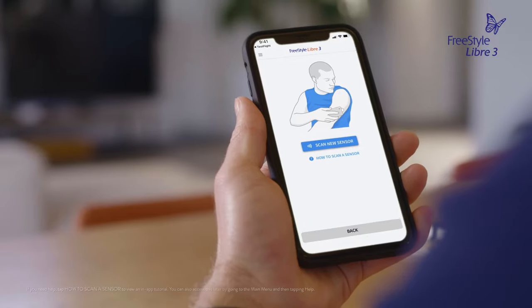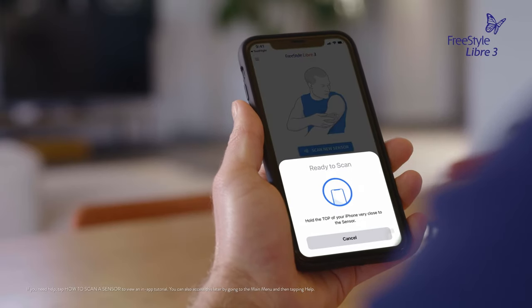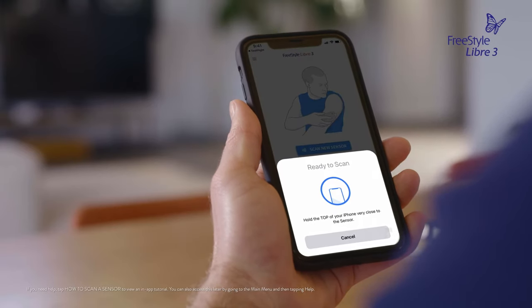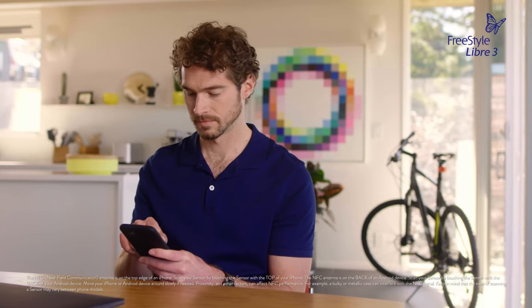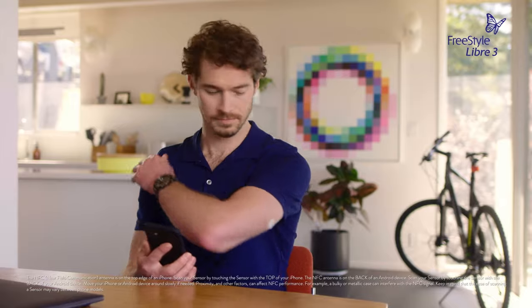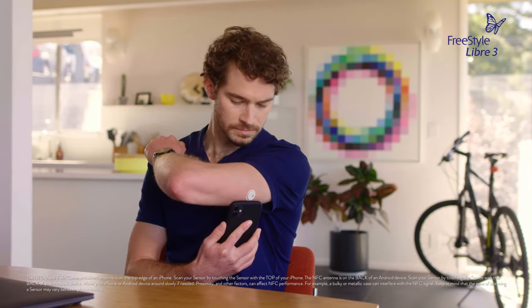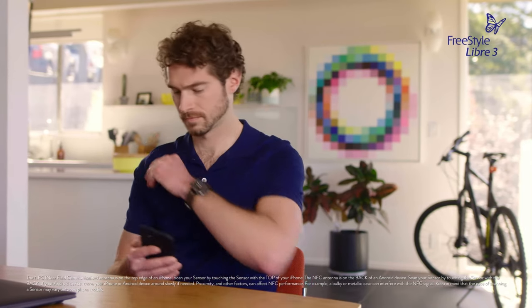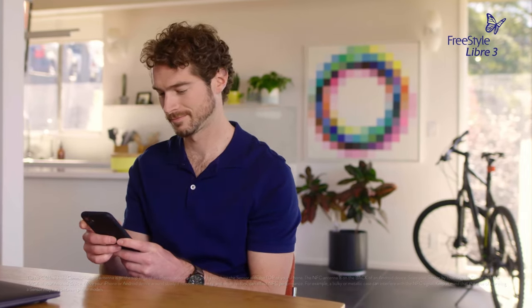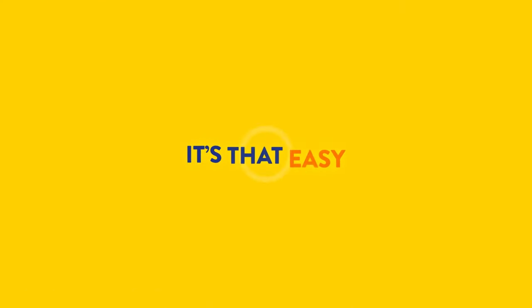To start a new sensor, you'll need to scan it with your smartphone. From the app home screen or from the app's menu, tap 'Scan New Sensor.' Your phone is now ready to scan the sensor to start it. Touch the sensor with the top of your phone slowly. Things like proximity, orientation, and phone cases can affect scanning. If needed, slowly move the phone around. You will receive a tone and vibration after you have successfully started the sensor. It's that easy!